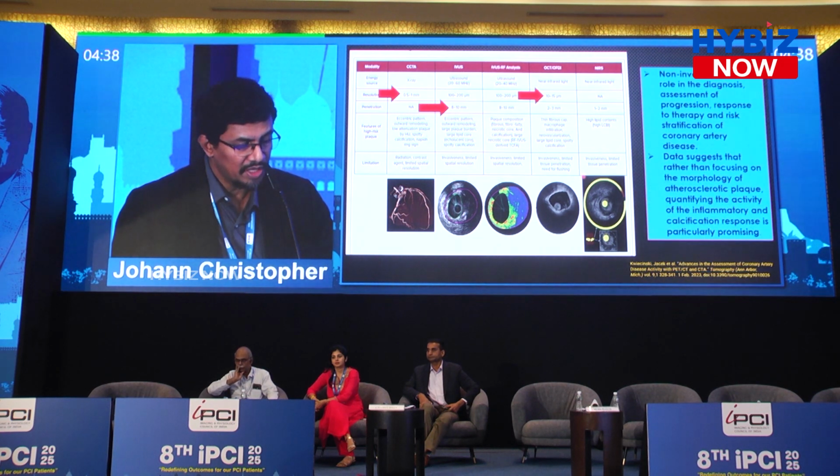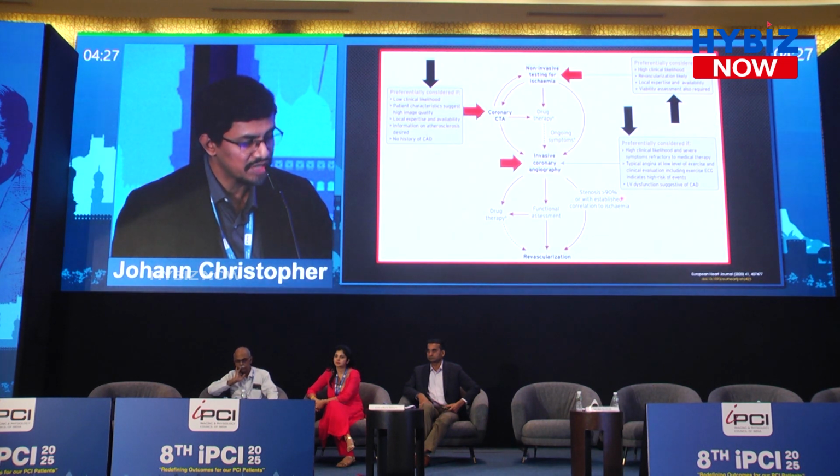Moving from stenosis to plaque morphology, we are now looking actually at function and inflammation of the plaque, which seems to be a very, very important part of why patients have an ACS.